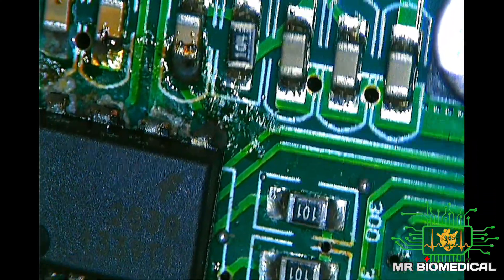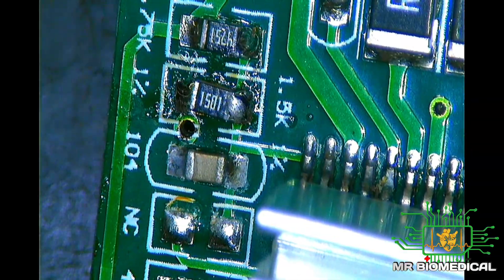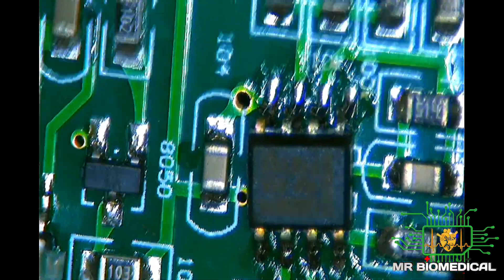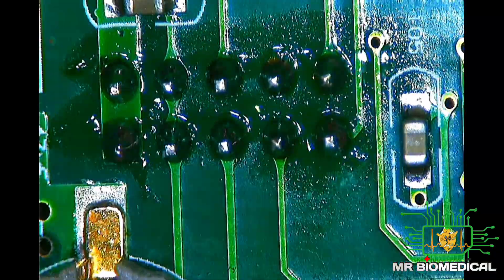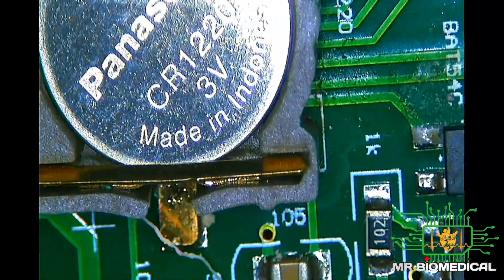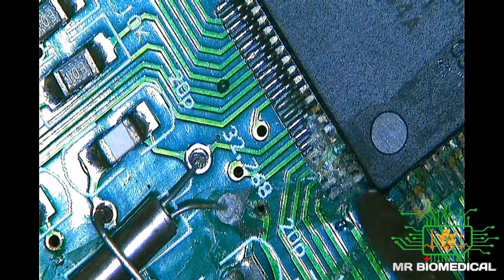This is the main board of the syringe pump. Let's look for any obvious components, damage, or missing components over here. Not seeing anything obviously wrong at first glance.